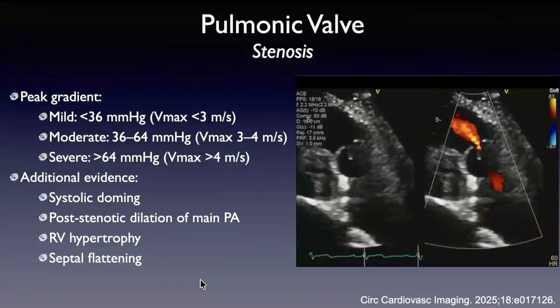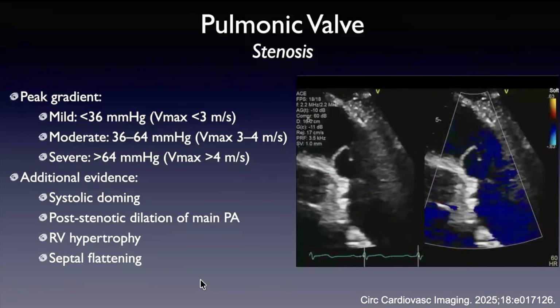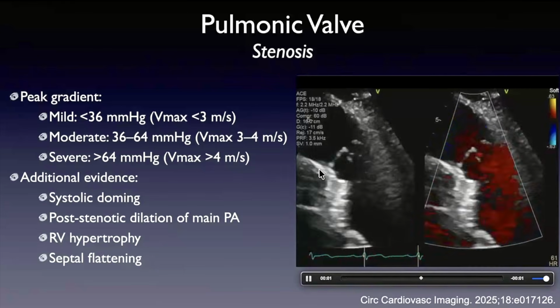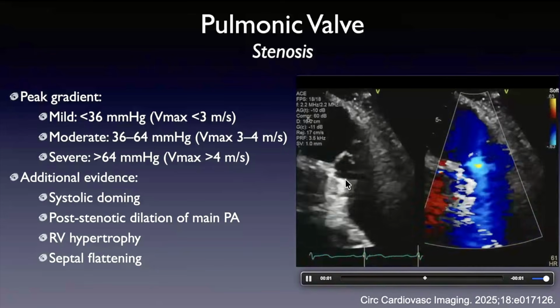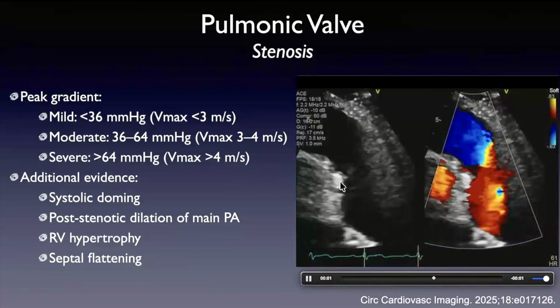So on the right side, you can see a pulmonic valve, a fairly thin cusps, looks to open fairly well. There's trace or mild pulmonic regurgitation. There's a bit of flow acceleration through the valve. You see here where you localize the flow acceleration. Remember I spoke about the sinuses. Here you can see almost a little bit of a waist here. If you look at the PA carefully, you'll see this not uncommonly in patients. Sometimes it's quite straight. Sometimes you see a little bit of an indentation here.